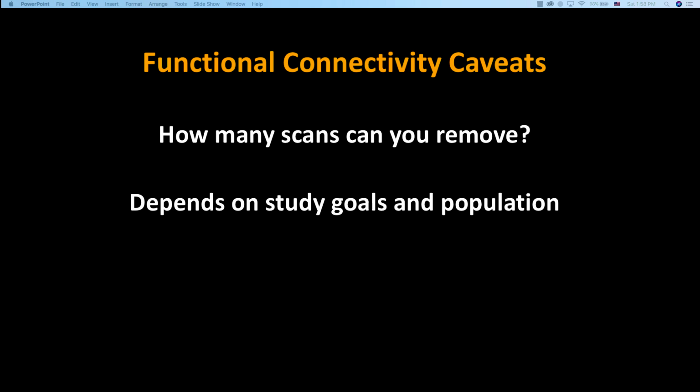Exactly. So you may have a criteria like I want 100 good scans of resting state data. And FIRMM will track in real time as they're being scanned whether this is a good volume or bad volume. Bad volume, it tosses it out, and you need to collect another one to fill in that gap until you reach the threshold. So if they're a good, well-behaving subject, they get out earlier. If they're a bad subject, they're in there forever. And you're in purgatory. So FIRMM, F-I-R-M-M, I forget what it stands for, but Damien Fair is, I believe, the developer or the lead author on it.